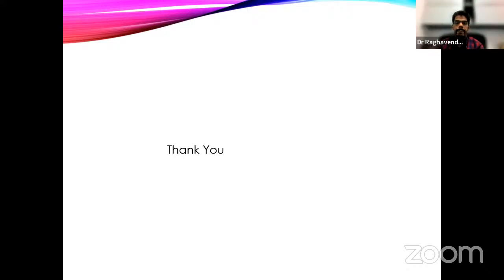A question has been asked: how is the Winston-Lutz test performed on the TrueBeam 6D couch, and what equipment is recommended? From Varian you get a test tool for the Winston-Lutz test. There is a small cube, you may be having it in your center, where the center of the cube has a small ball bearing, which can be used for that. Or as I said, we don't have to depend on anybody. We can design our own thing.